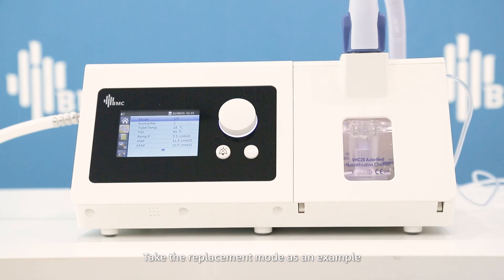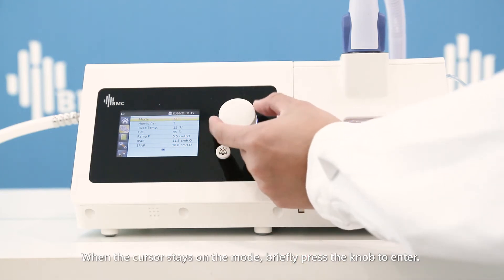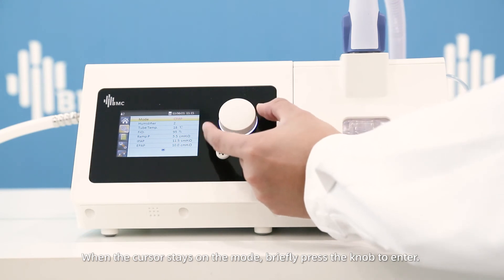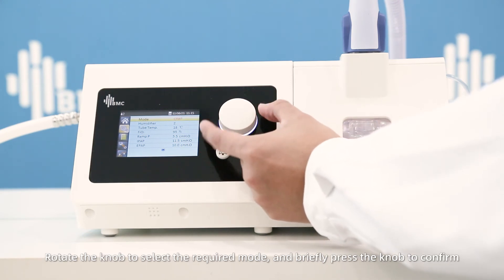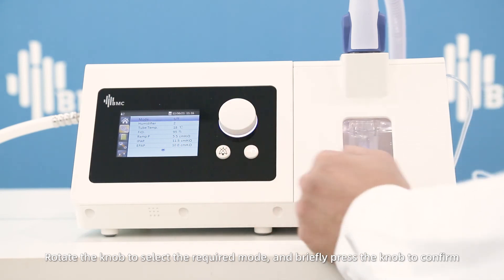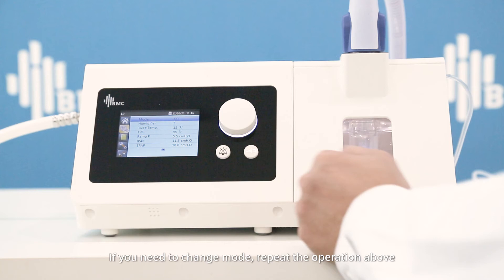Take the replacement mode as an example. When the cursor stays on the mode, briefly press the knob to enter. Rotate the knob to select the required mode and briefly press the knob to confirm.